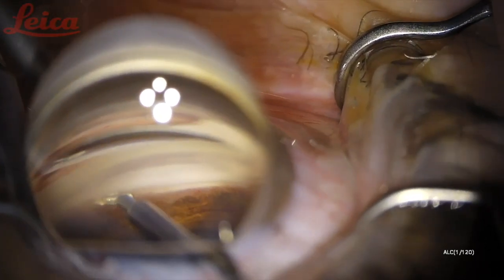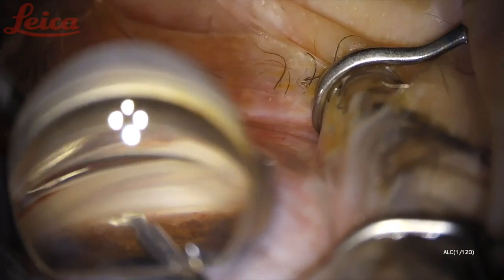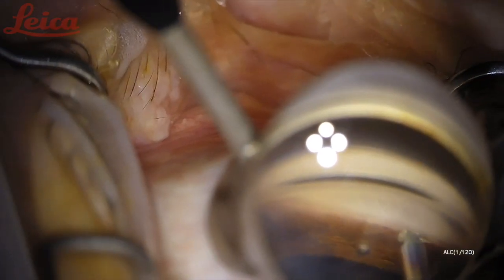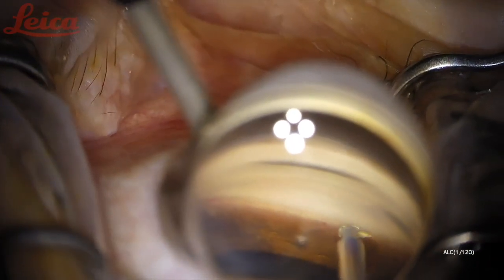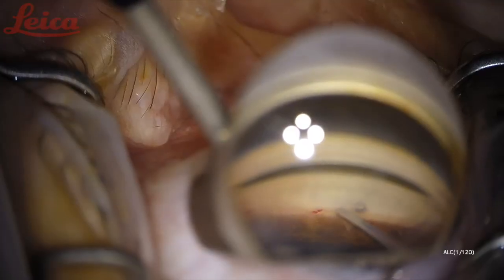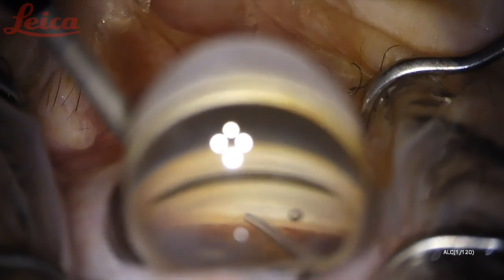It does have a very sharp tip that can engage the back wall of Schlemm's canal, so sometimes you have to adjust your hand as you follow the curve of the eye. I usually do just a forehand long sweep, but I'll sometimes backhand a little bit to get some additional trabecular meshwork, and then viscoelastic there just to get a look at the cleft.